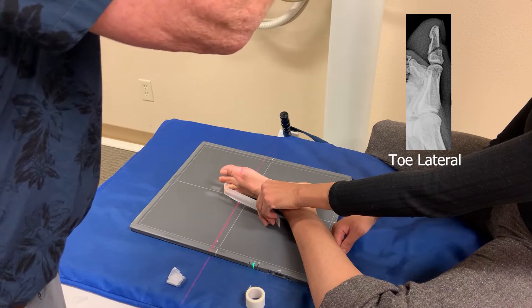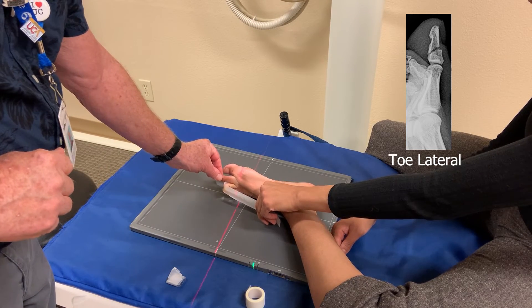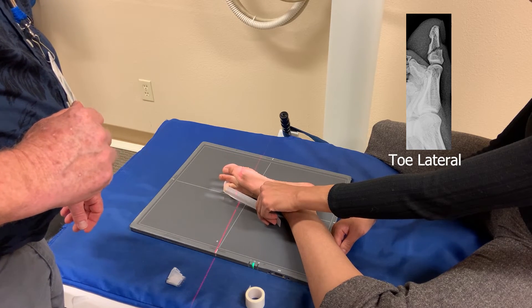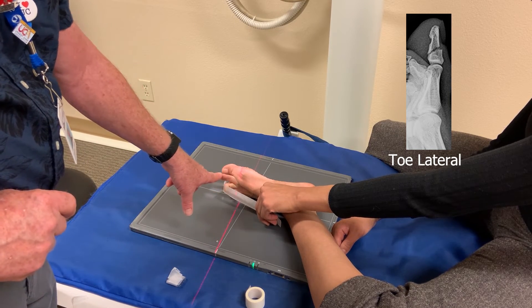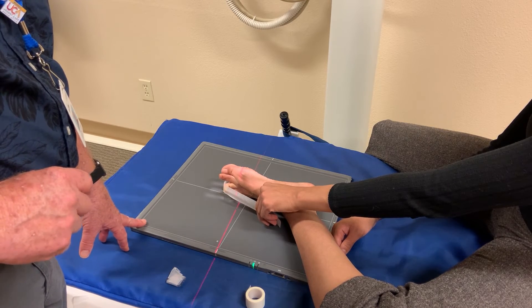There we go. Now we're separating that toe. One way to do it — you have to experiment: do they go forward or back? This looks like a pretty decent view of that second toe. Position trumps distance. I'm not worried about that distance there; I just want to get that toe in as much of a lateral position as I can. So there you have toes. Be safe out there.